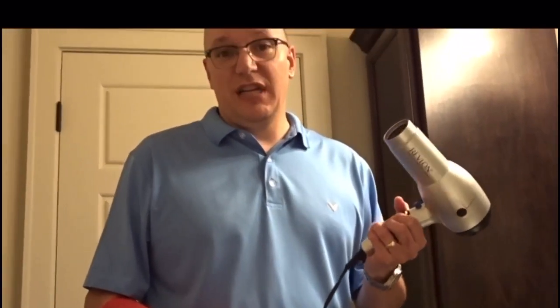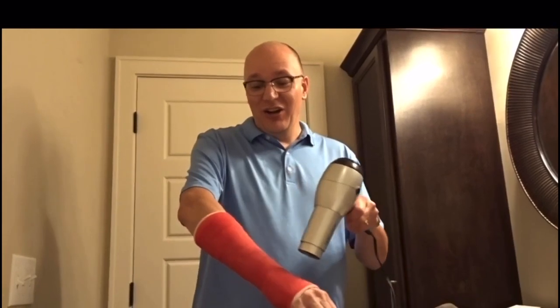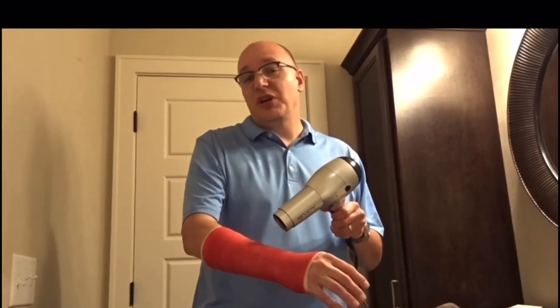The other option if you need to get ready sooner is you can get a hair dryer, put it on whatever temperature setting is comfortable for you, turn it on, and just blow dry it. The cool thing is you can actually feel the air flowing through your cast, so it feels good and takes away some of the itch as well. You can completely dry it in about five minutes.